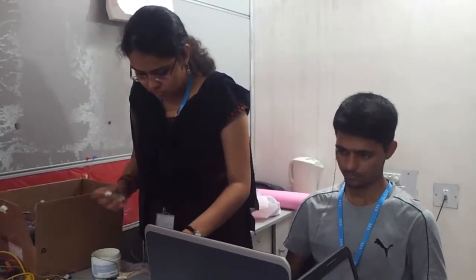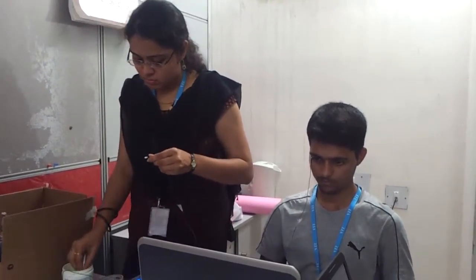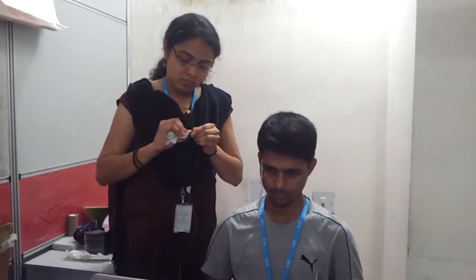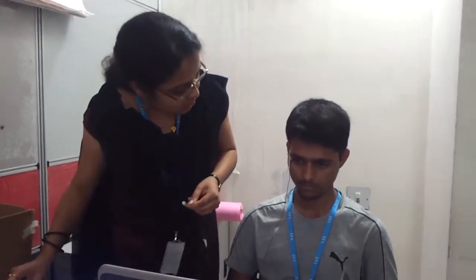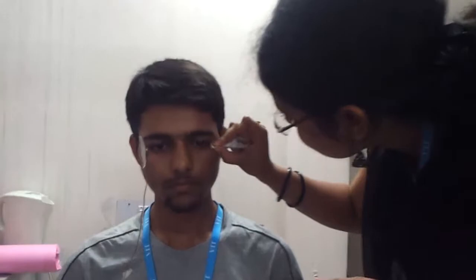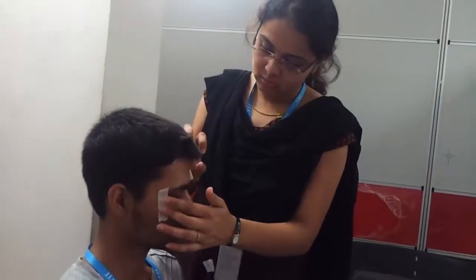Since the electrodes are connected to the differential channel, the difference in the movement is recorded. Again, I apply the electrolytic gel and place the electrode on the other end of the eye. There is also a ground electrode which I place on the forehead.